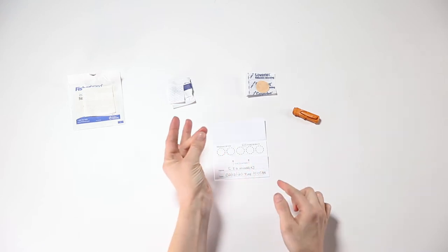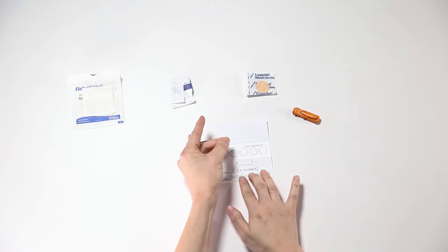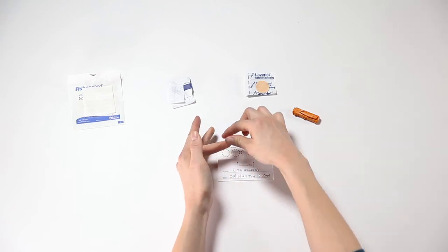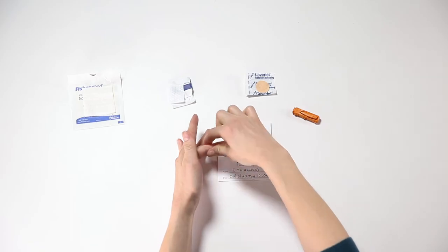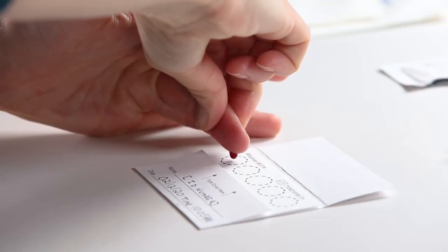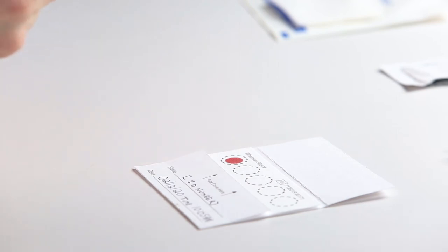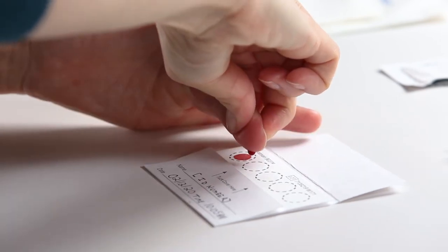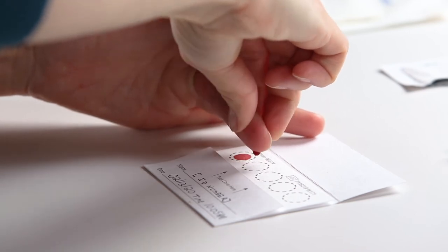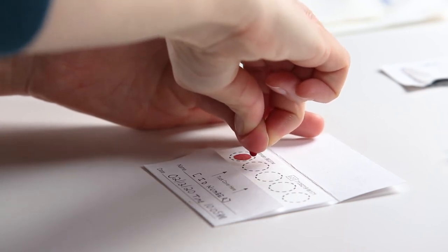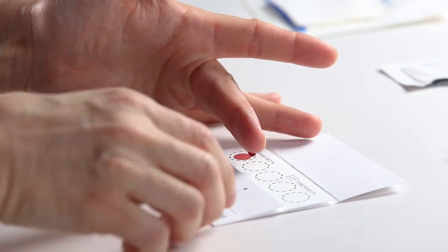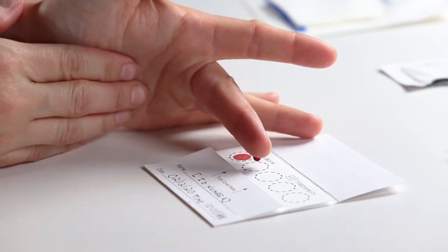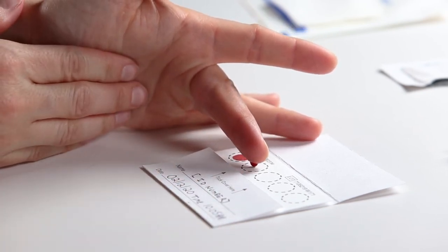One at a time, place one drop of blood in each of the five circles, being careful not to touch the card with your finger. You can gently touch the card to the blood, allowing it to absorb the blood away from the finger, but do not touch the card with your finger. Try to ensure that blood only lands within the circles. Frequently wipe away blood from the puncture site. If blood is allowed to stay at the puncture site, it will begin to clot and blood flow will stop.